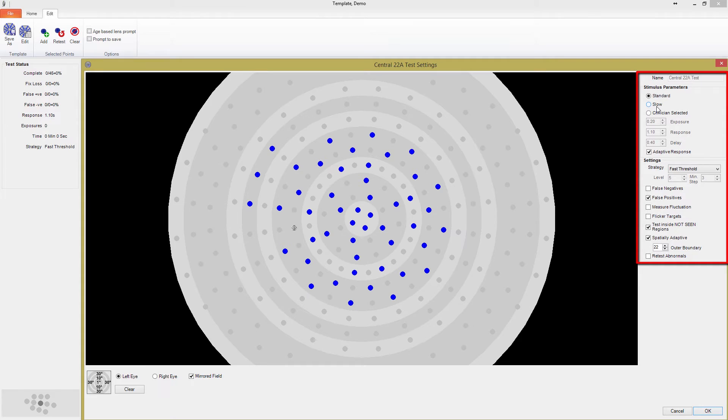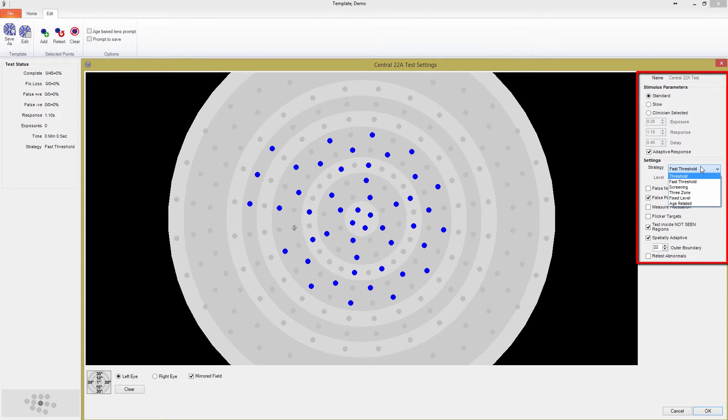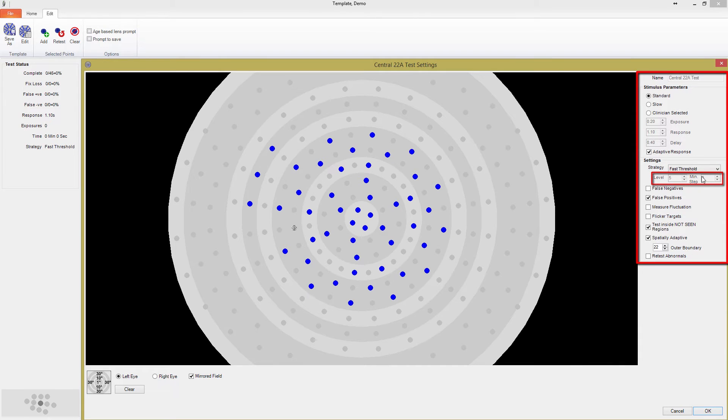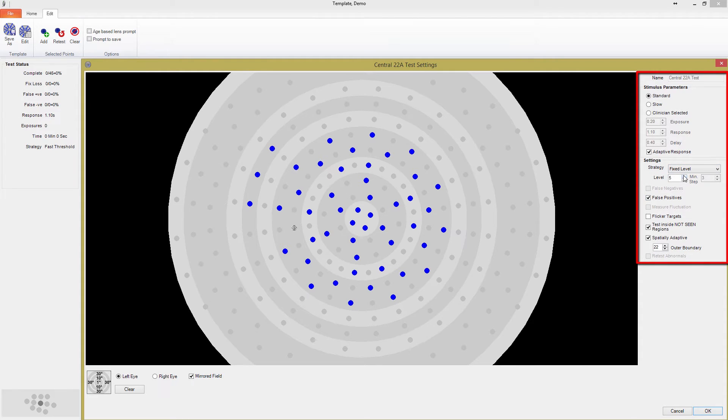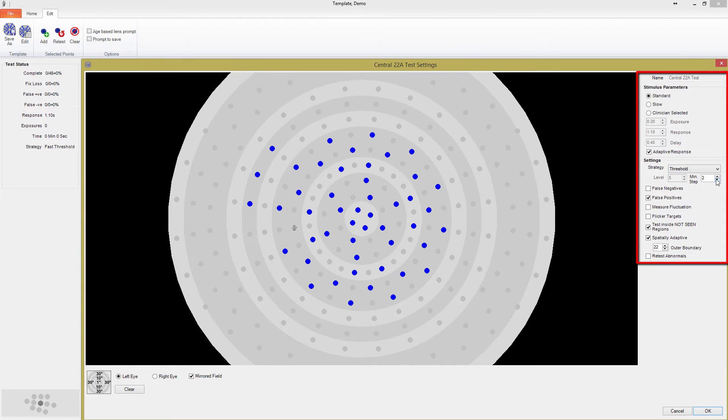Moving down the list, we're finally at the test strategy selection stage. Pressing on the drop down menu shows the list of available test strategies. You thought you were going to finally learn what all the strategies mean, but you're going to have to wait a little longer. However, you will notice the level and the minimum step boxes are faded out. The level box applies only to the fixed level strategy and is the initial exposure brightness in decibels. The minimum step box is only available for the thresholding strategy, which uses the classic staircasing method many of you will be familiar with.